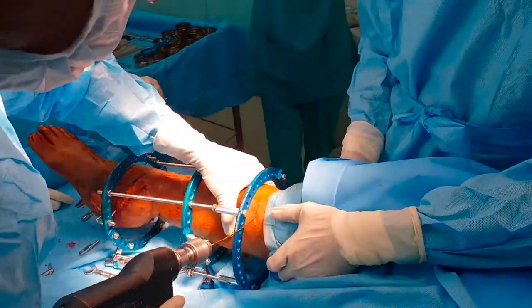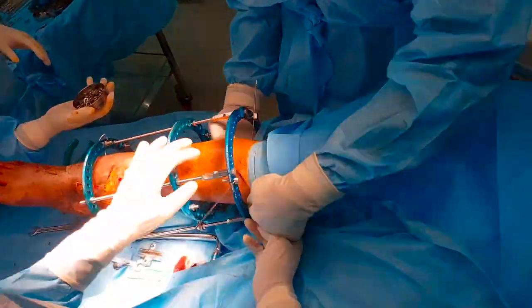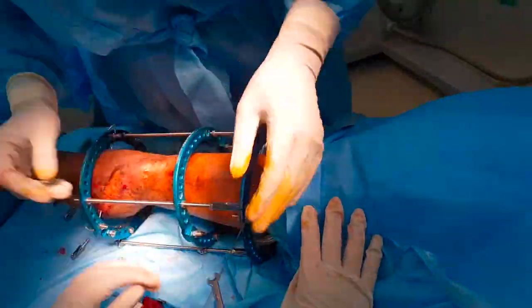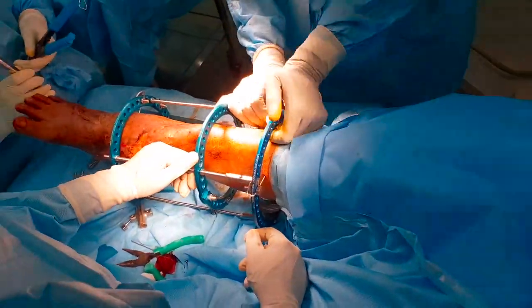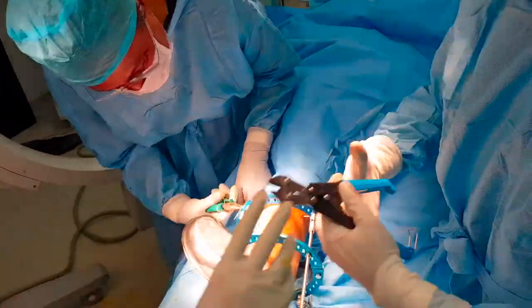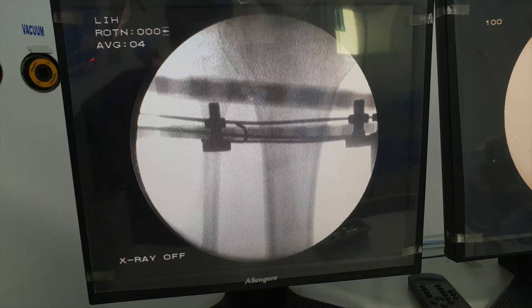The second reference wire is a medial-lateral wire on the proximal ring. Once again, this is attached to the ring — one side tightened and the opposite side tensioned by twisting the nut 90 degrees. At this stage, the frame can be moved from side to side to adjust the gaps. We must ensure that the side-to-side gap is equal — anteriorly a little less and posteriorly a little more. A C-arm image confirms the correct level of the ring.